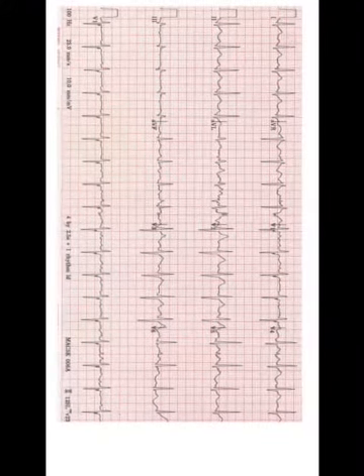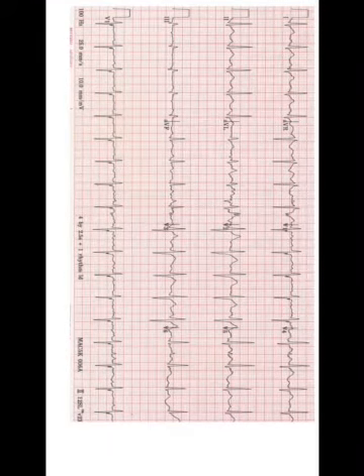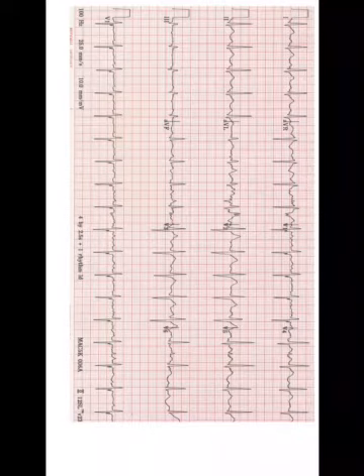As you become more experienced in interpreting your 12 lead EKGs, you're going to figure out your own pattern and your own technique on how to approach the interpretation of a 12 lead EKG. You could probably talk to 5 different paramedics, and those 5 different paramedics interpret the 12 lead EKG in a different format.